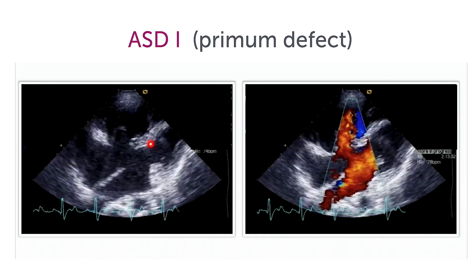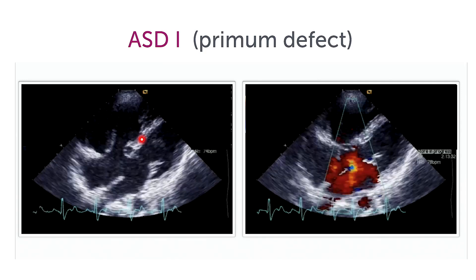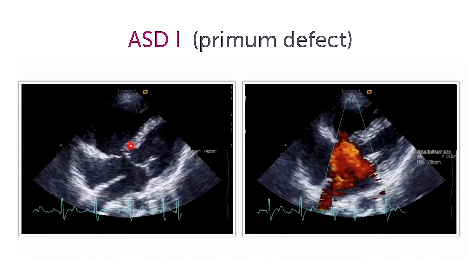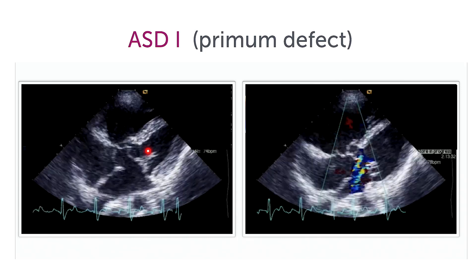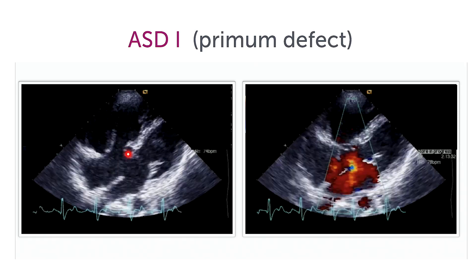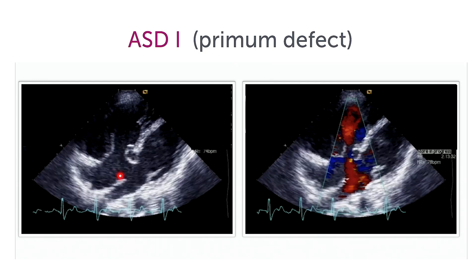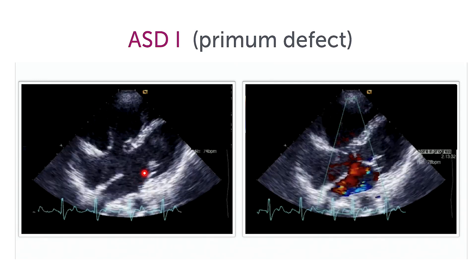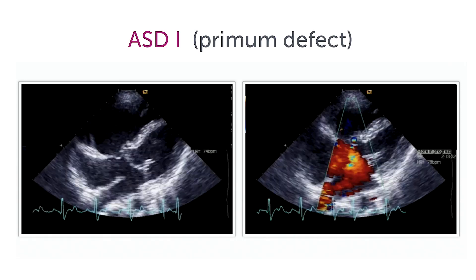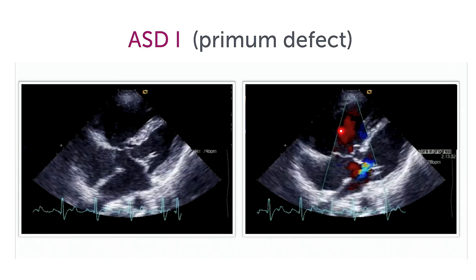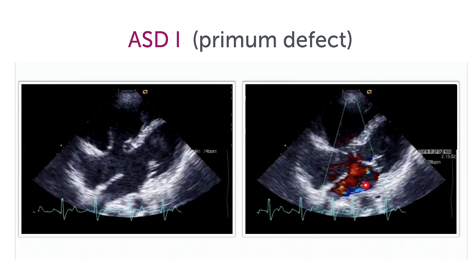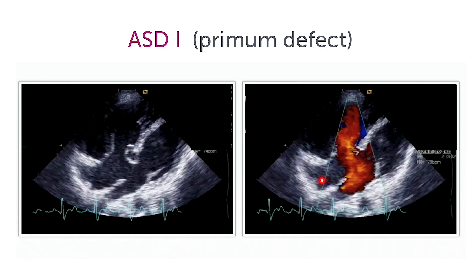But if you look closely, you will see that this part of the interventricular septum is also not completely normal. As a matter of fact, what you have here is an aneurysmatic sealed ventricular septal defect. So if you want to define this correctly, it would be a complete AV canal defect with a sealed VSD. But the important finding here is this shunt between the right and the left atrium, which can best be appreciated in an angulated view.